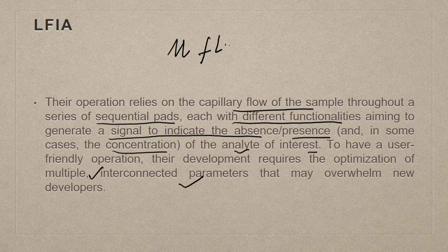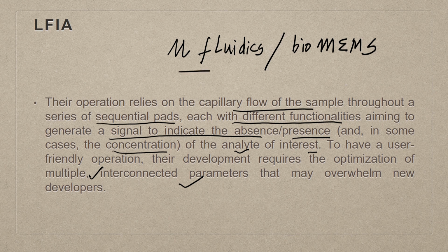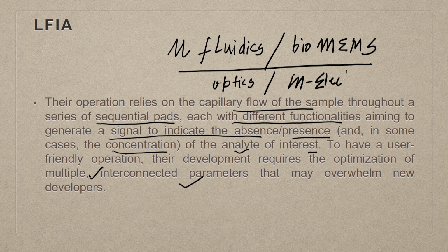microfluidics, biomems, and optics, and microelectronics, because much of these assays relies heavily on engineering these devices.